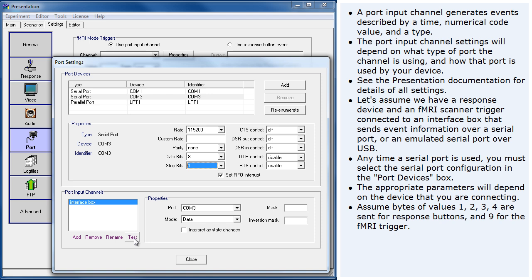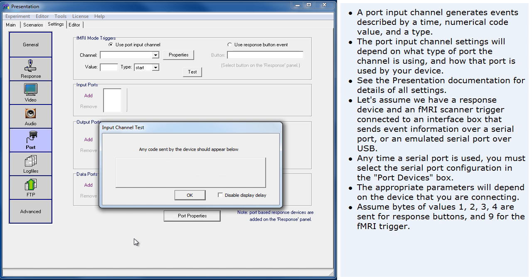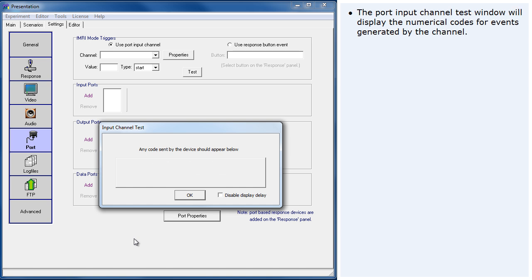Assume byte values 1, 2, 3, 4 are sent for response buttons and 9 for the fMRI trigger. The port input channel test window will display the numerical codes for events generated by the channel.